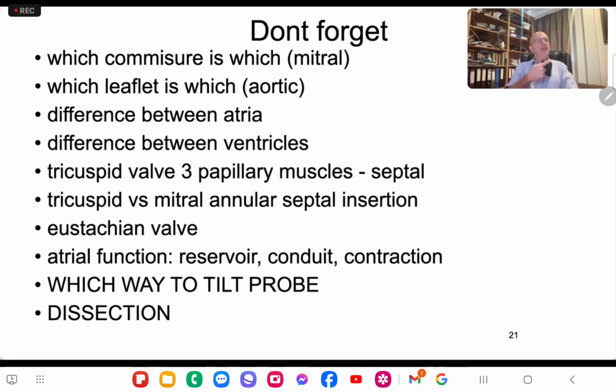Next time you're scanning, if you remember, you take your scan head out of the scan. You get a sheet of ultrasound like that, don't you? And wherever you put your scanner, that sheet of ultrasound cuts through the middle of you.